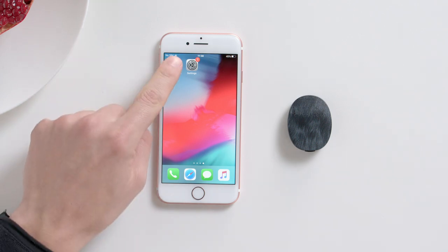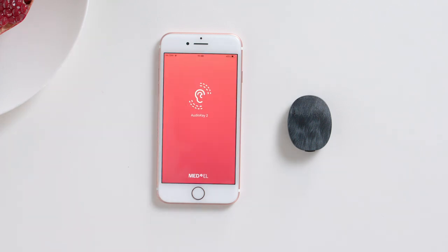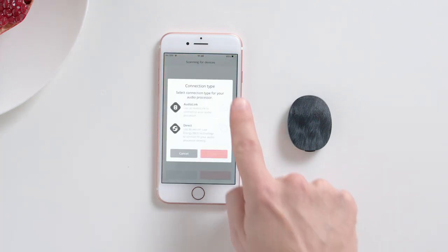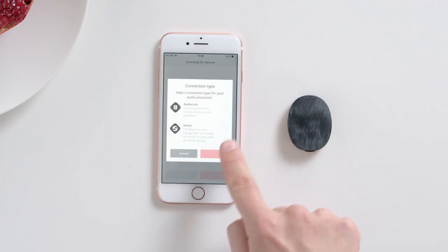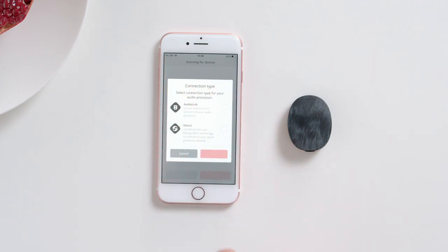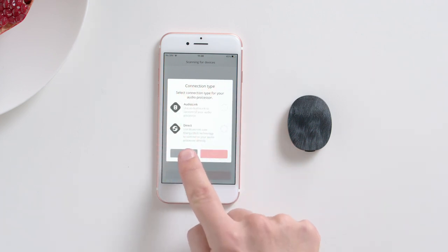Open the Audio Key 2 app. The pairing screen should automatically appear. Then select the Direct Connection option and tap Next.